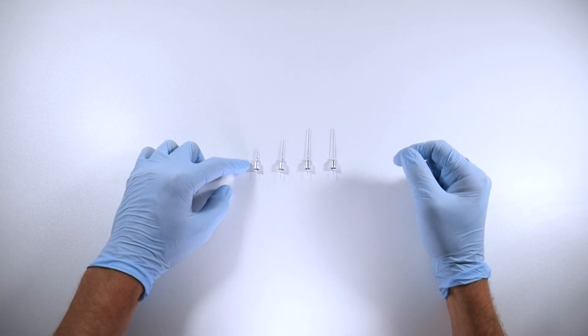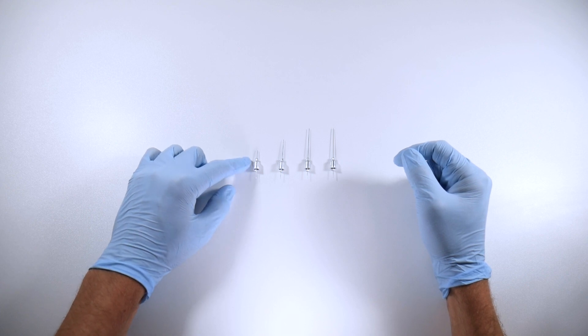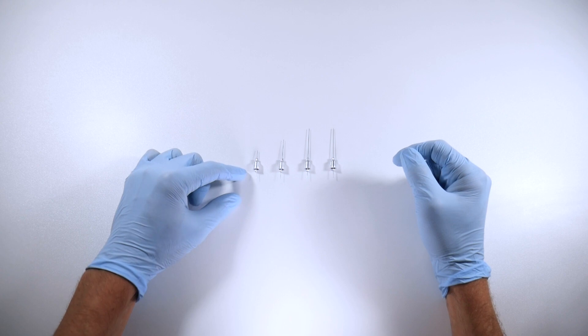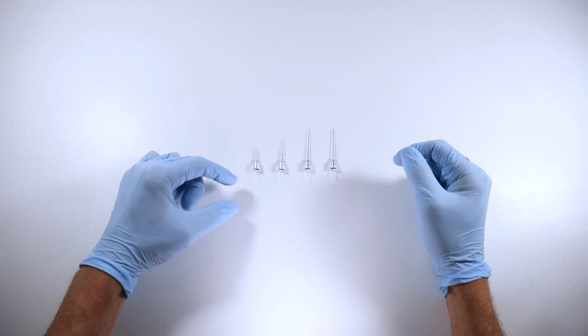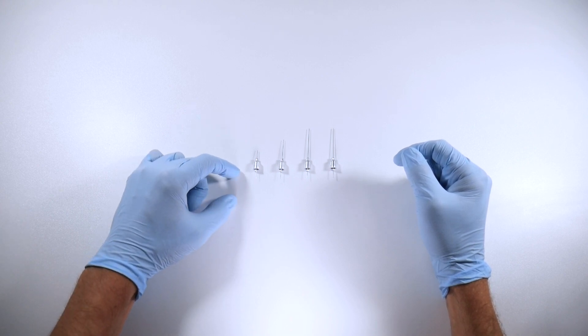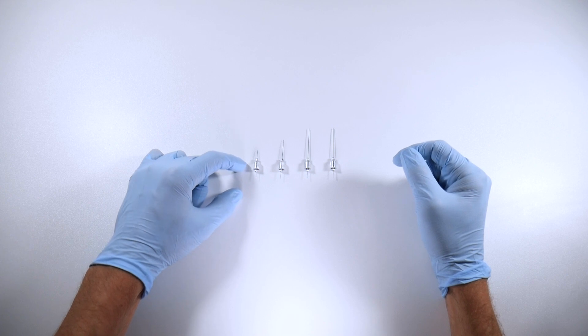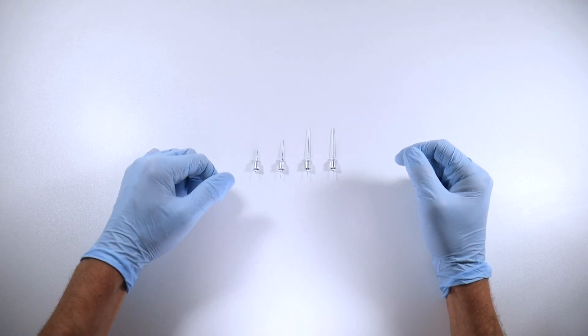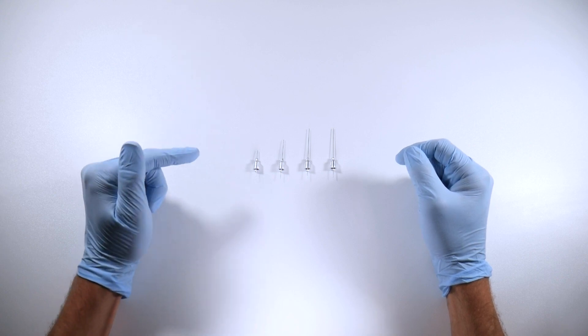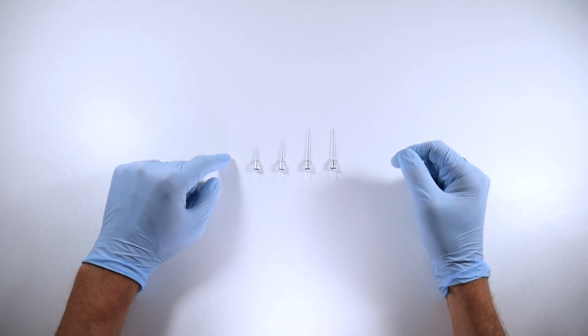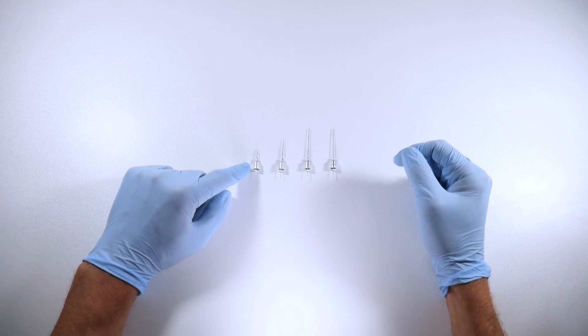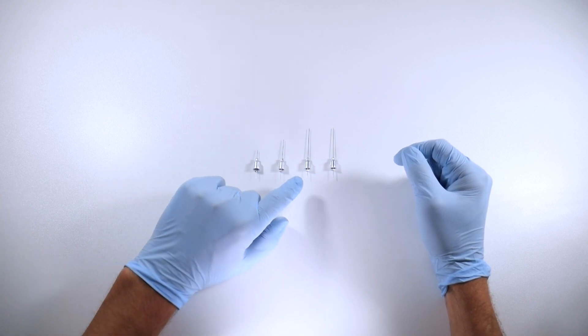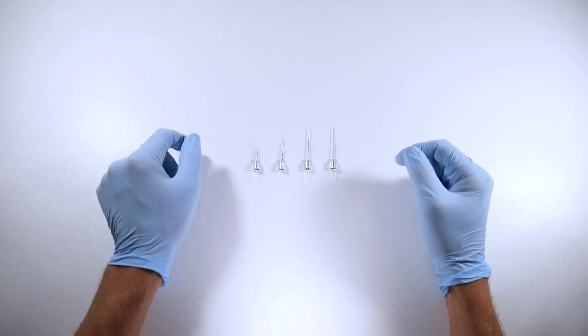So here we are, we've got our needles here, all different lengths. Starting with the extra short needle - this is a great one for a couple different injections. One is the PDL injection. When you're doing a PDL injection, you're going to be applying a ton of pressure, lots and lots of pressure. In order to keep the needle seated properly and get the pressure that's necessary to get that solution to go down into the bone, you need to have a shorter needle.